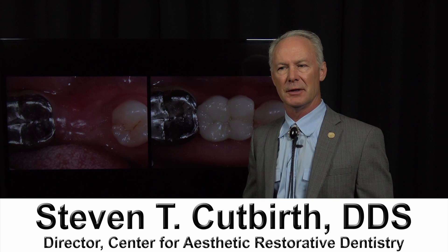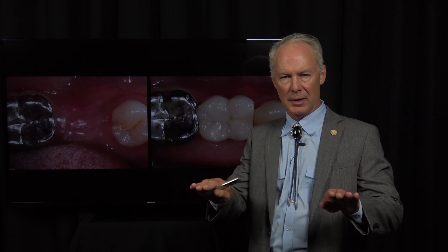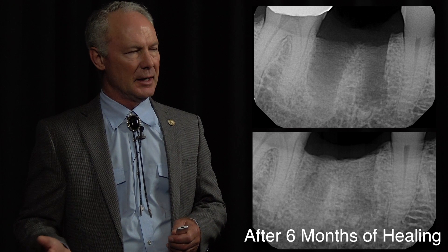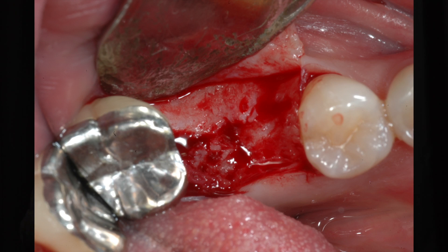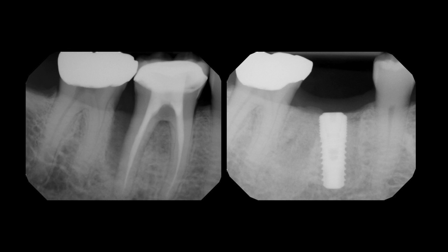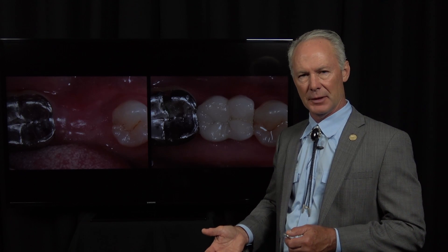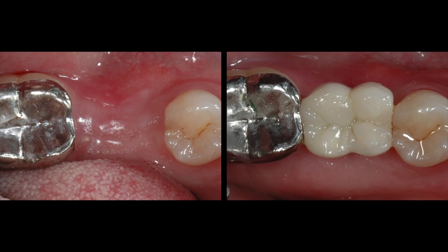In this three-part series, we've extracted a lower first molar. We've grafted it with platelet-rich fibrin and a resorbable collagen membrane, and let that heal for six months. Then we've placed a root form implant and let that heal for three months. Now we're going to uncover the implant, take an open tray impression, fabricate an implant abutment and crown, and seat the restorations.